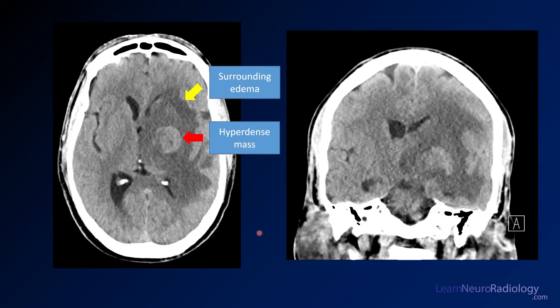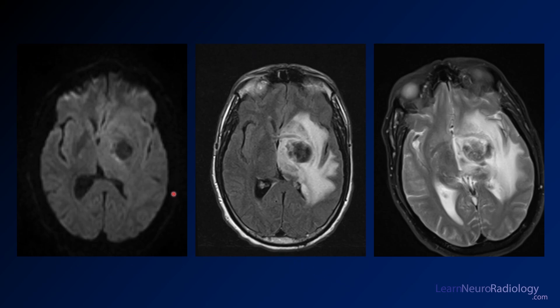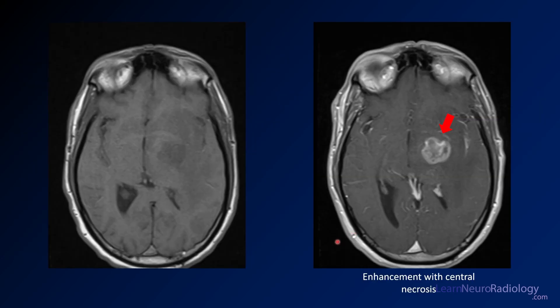Here we have the CT. You see this hyperdense mass in the left basal ganglia — that's a nice characteristic that should help you think about lymphoma. You've got a bunch of surrounding edema in the basal ganglia, extending into both the temporal lobes and the adjacent frontal lobes. On the MR, it's a little bit dark on diffusion — maybe there are some blood products there. Pretty dark on T2 and FLAIR, but you've got a ton of edema surrounding this lesion of the basal ganglia.